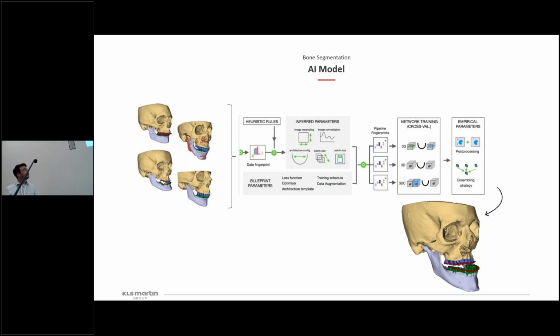And we fed that as training data, created a pipeline for that, used a state-of-the-art AI model for that, and then had some post-processing for normalizing basically the data, bringing it into the same coordinate system to get then a smooth segmentation automatically of some DICOM data. The whole process in runtime currently needs about 3 minutes to run. So it's really, really quick, not too resource hungry, although a normal laptop is not really suitable, I have to admit.